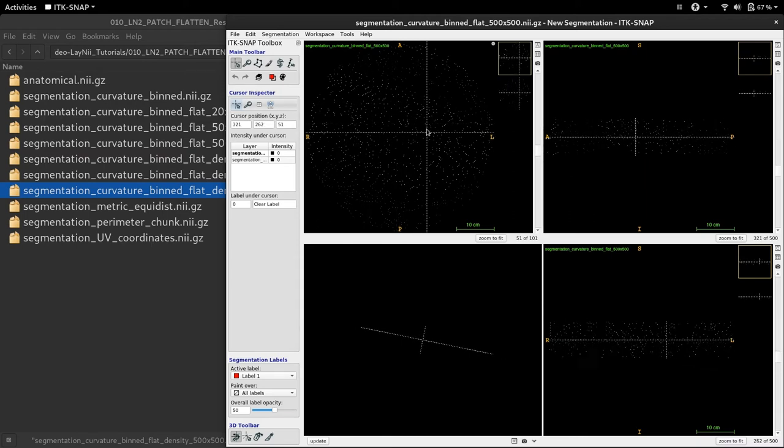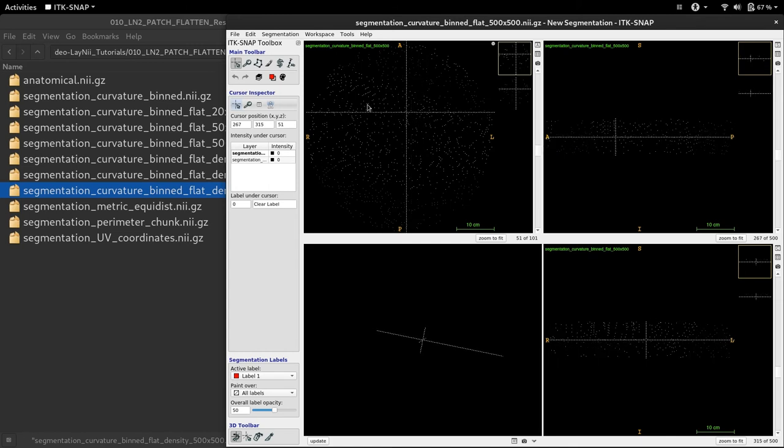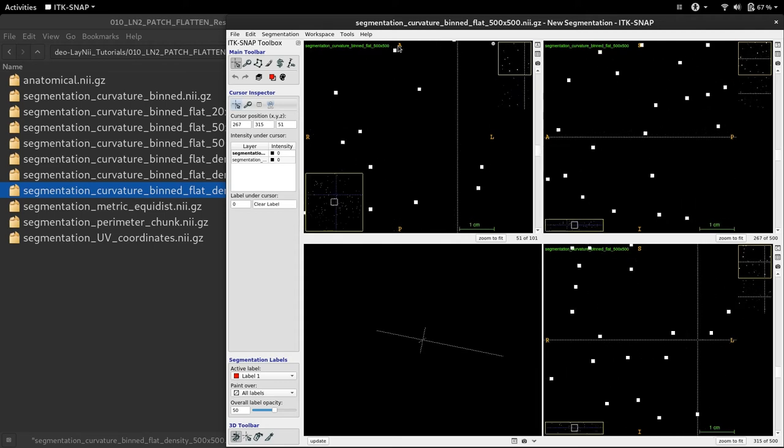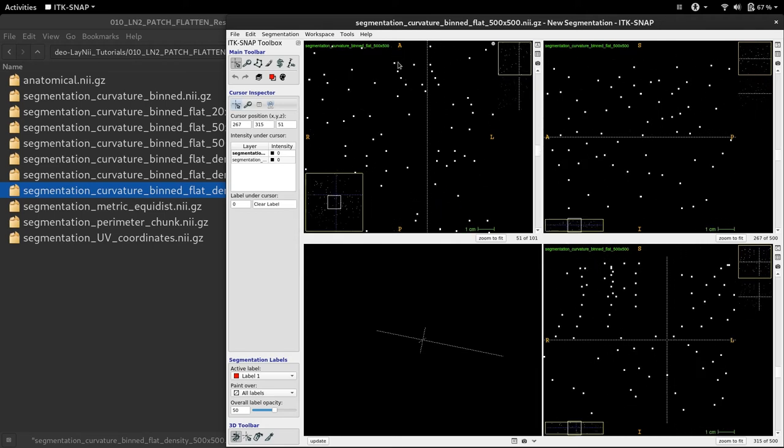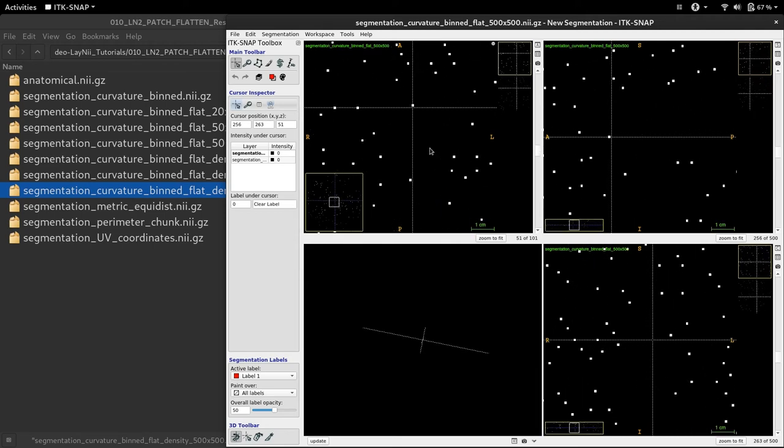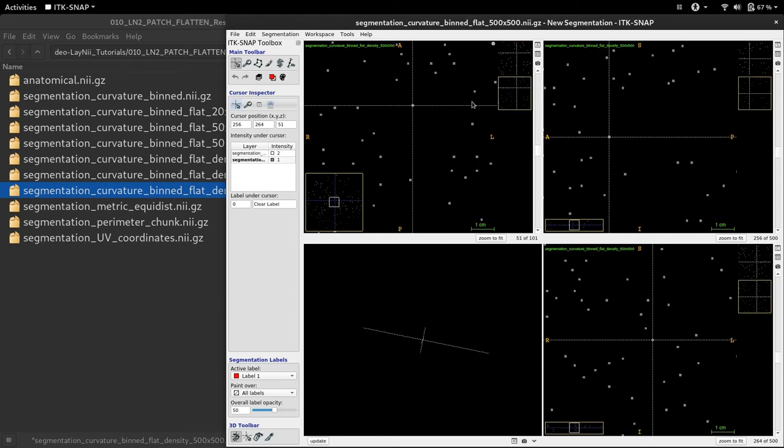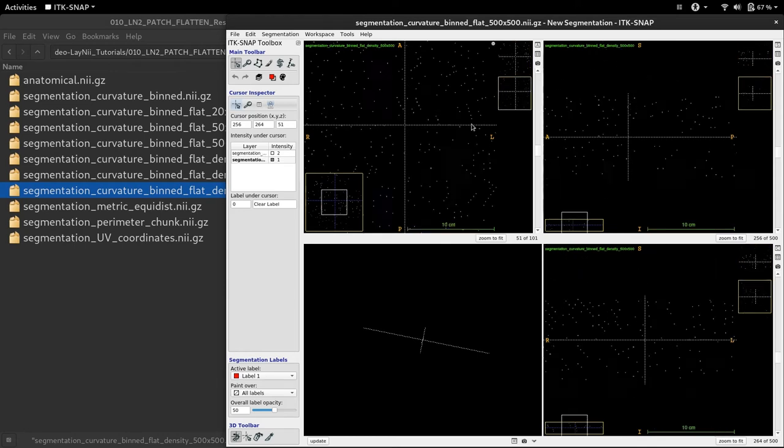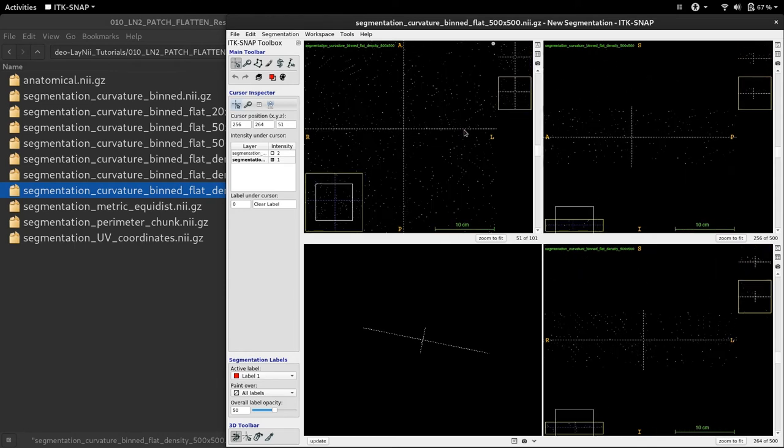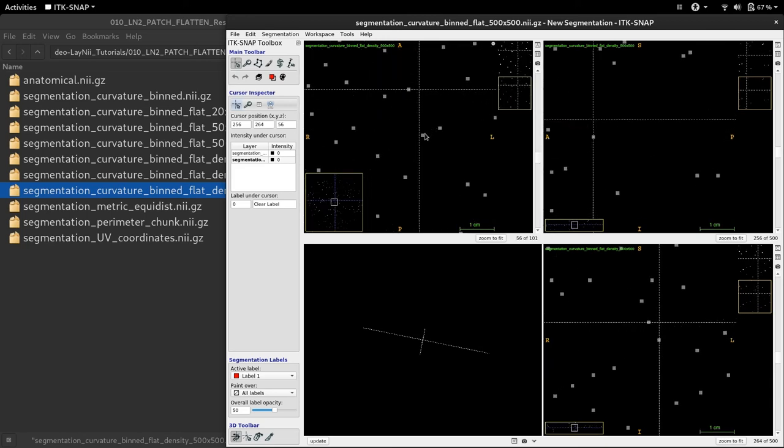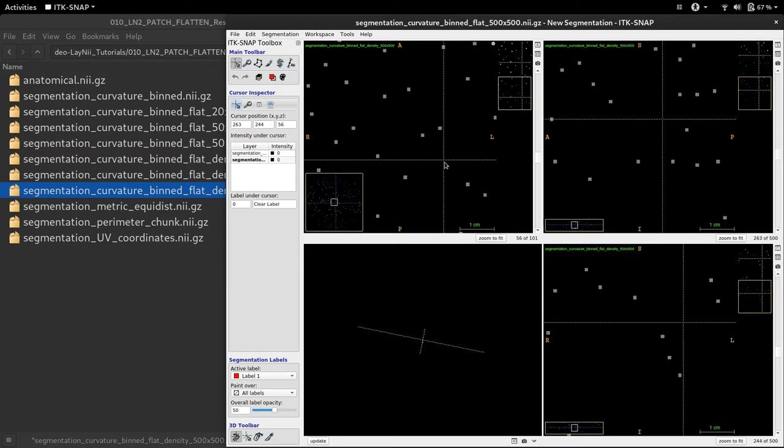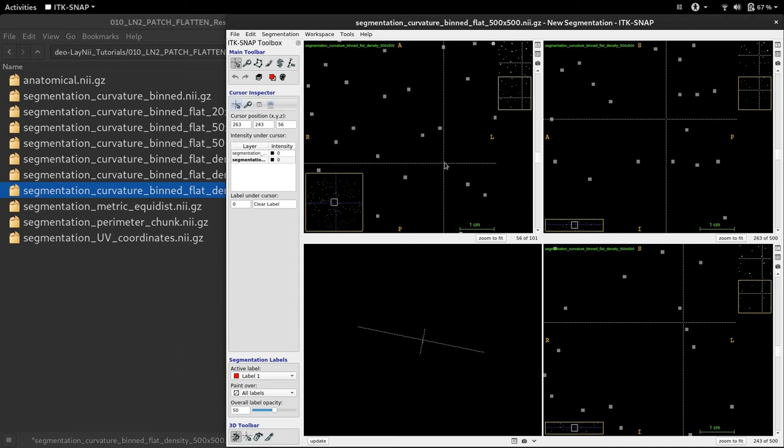What is going on? Here you can see that we have so many bins in X and Y of the flat representation, we no longer have the condition where multiple folded brain voxels fall into the same flat representation bin or voxel. We can zoom in. Each of these dots are exactly the information coming from a single folded brain voxel. I can check this by checking the density file. In the density file, you'll see that almost all of these dots are labeled with 1, which means there's only one voxel falling into that bin. And there are actually 0 voxels that fall exactly to this U, V and D combination in the flat representation.